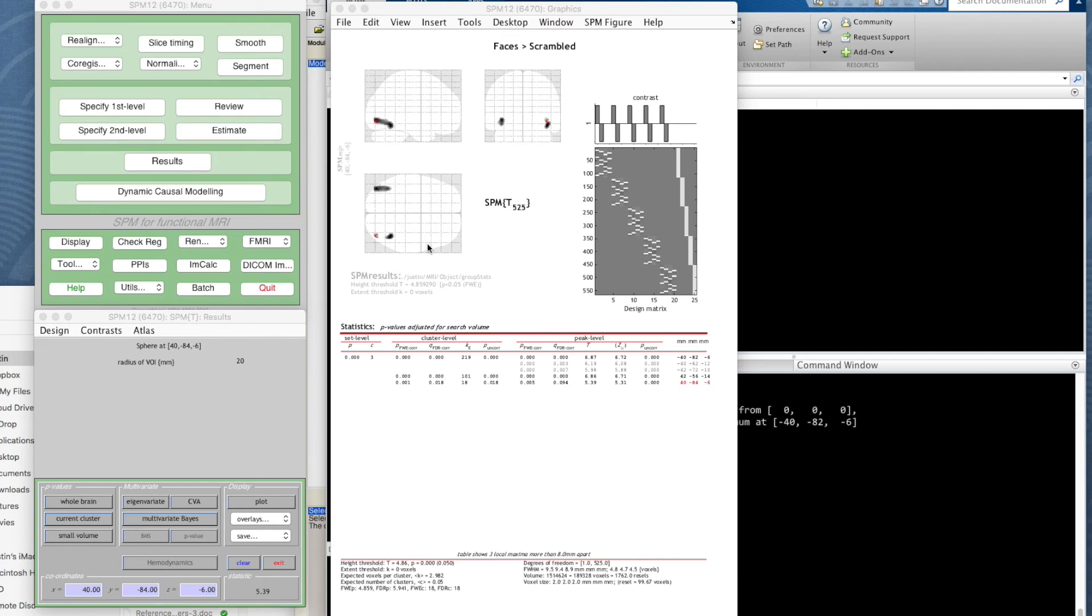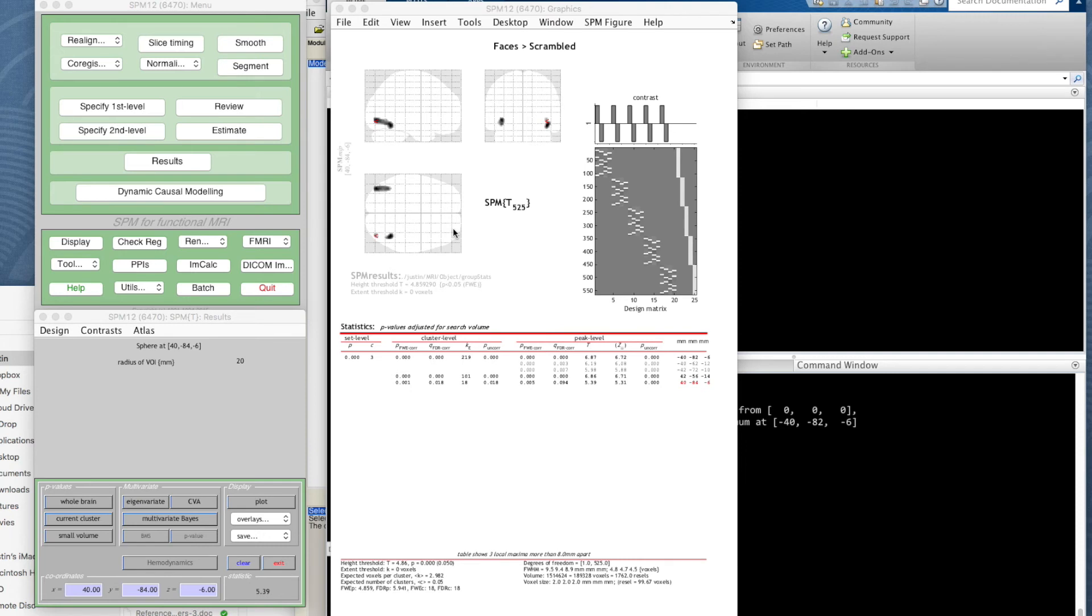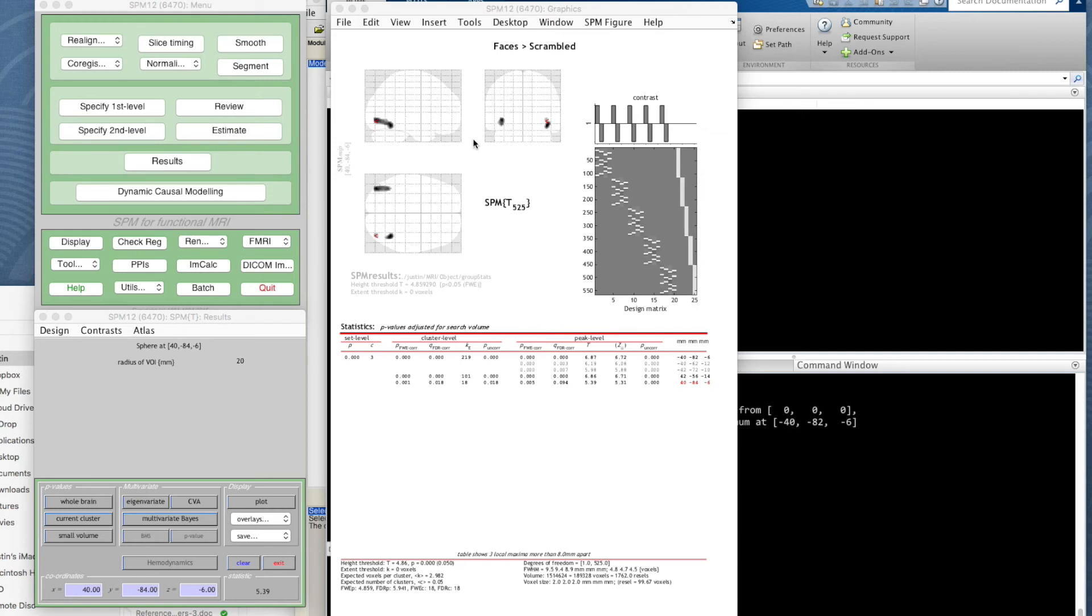This might look like just a couple of small blobs, but it's actually a really good result. What would be bad is if we had absolutely nothing at all, or lots of stuff all over the place. Lots of stuff all over the place suggests you've done something terribly wrong with the analysis or you've got a really badly designed experiment. Typically you'll design a study to highlight a small region of processing, and here this is exactly what we've got. Admittedly, this is the average effect across these five participants—we can look at them individually later—but this is good data.